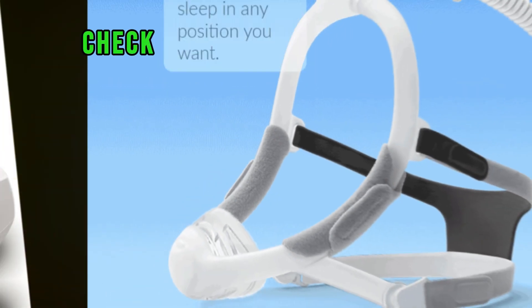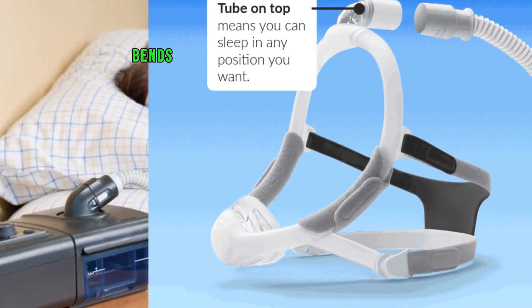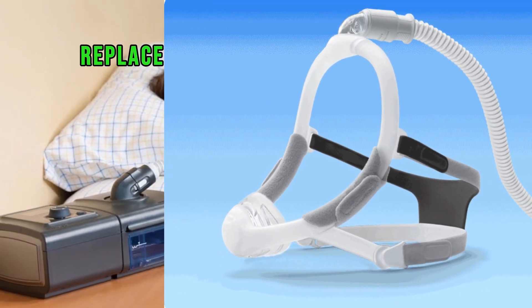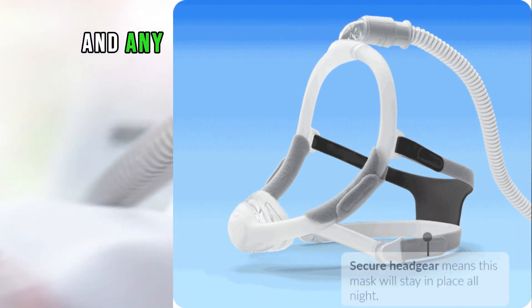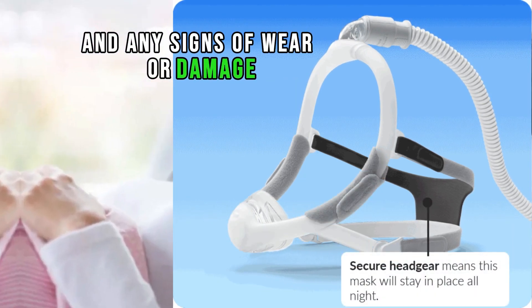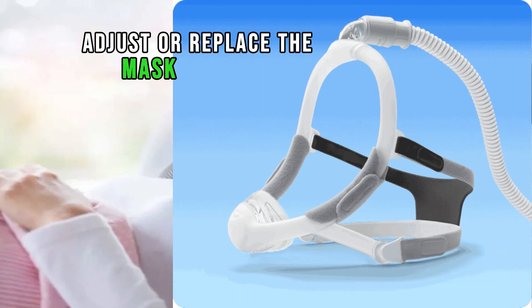Inspect tubing and mask. Check the tubing for any kinks, bends, or leaks, and replace damaged tubing as necessary. Inspect the mask for proper fit and any signs of wear or damage. Adjust or replace the mask if needed.